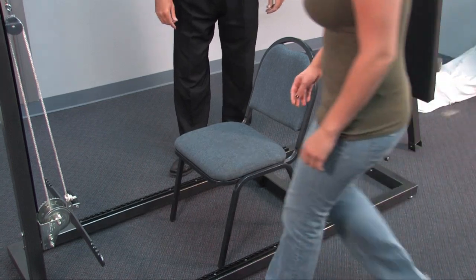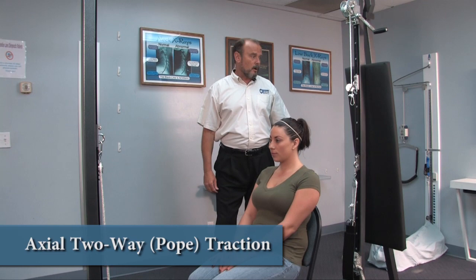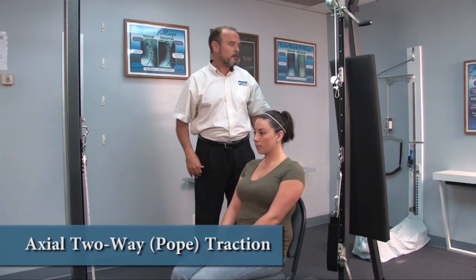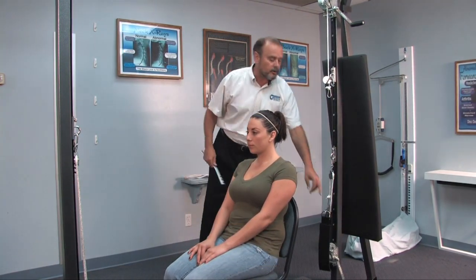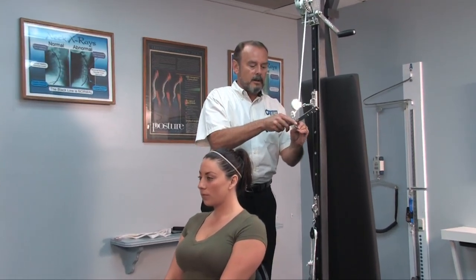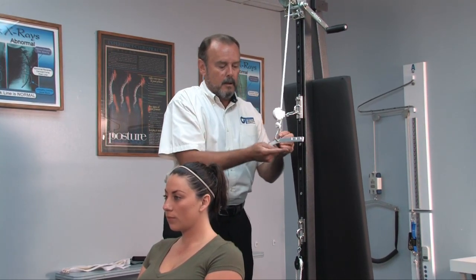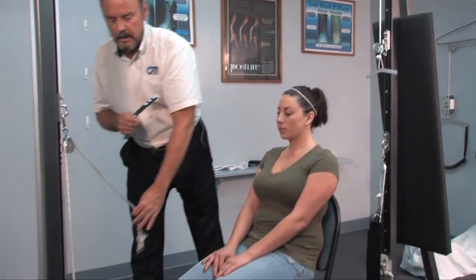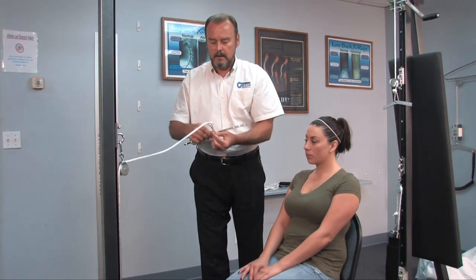I'll have Amanda come on back in and let her take a seat. Now I want to show you a setup for what's called an axial two-way type of cervical traction, also more commonly known as a Pope traction. We have already taken off our large crossbar, and I'm going to have you put the small crossbar in place now on the back section right there.